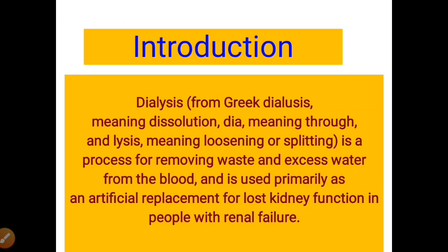Dialysis is a process of removing waste and excess water from the blood and is used primarily as an artificial replacement for lost kidney function in people with renal failure. Actually, it is used for people who have problems in their kidney function.